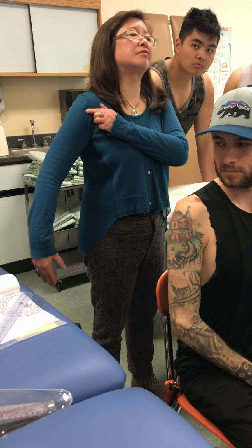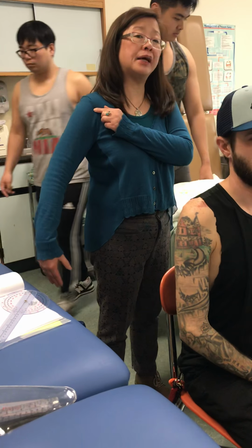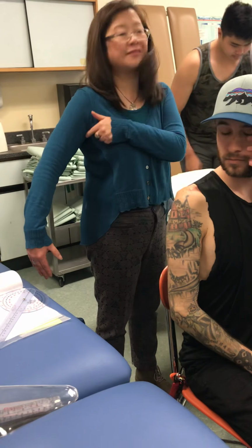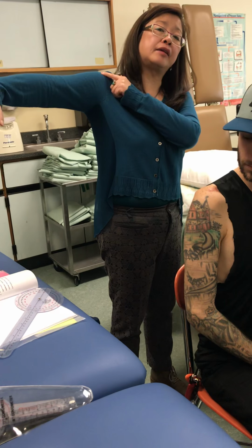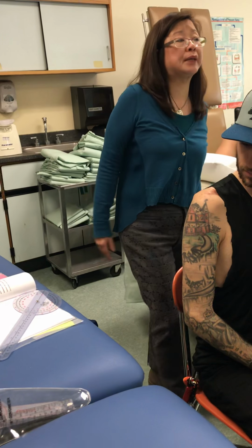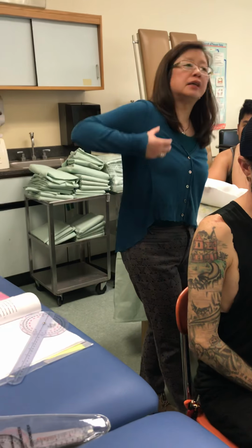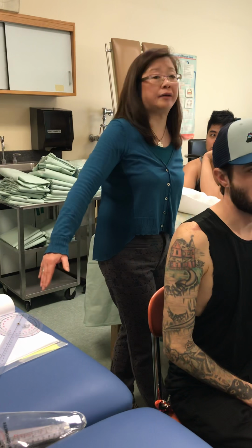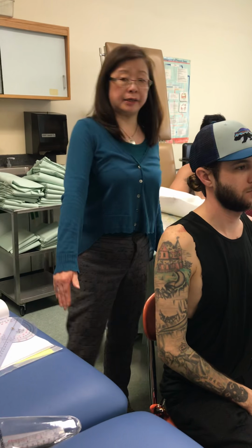What position is this already in? Abduction. Alrighty? So you're going to want to measure from where abduction is. So if they're stuck out here, say 40 degrees, and they go up to 90, that's 40 to 90 degrees. Zero for abduction is always going to be there no matter what. If they have a pathology in their shoulder, 99.9% of the time it's going to be stuck somewhere in abduction. Very rarely in adduction.